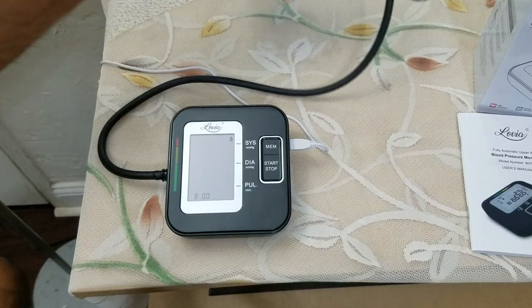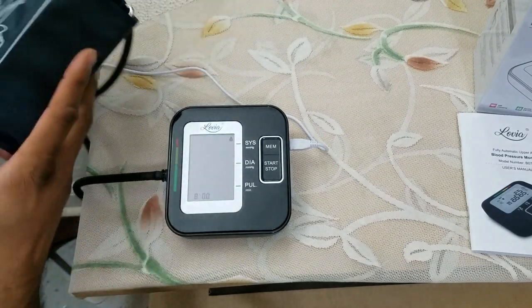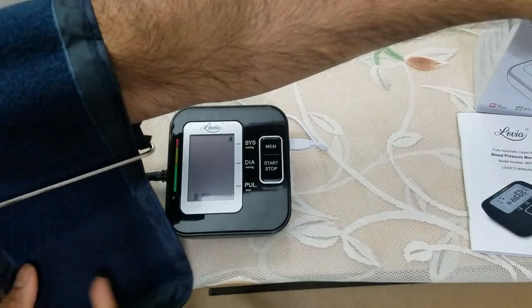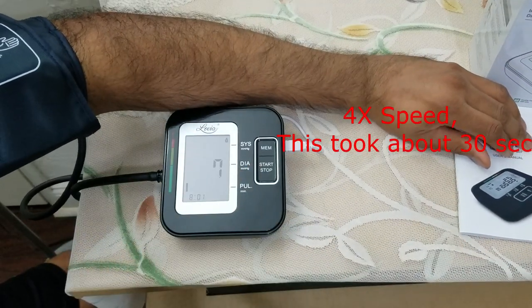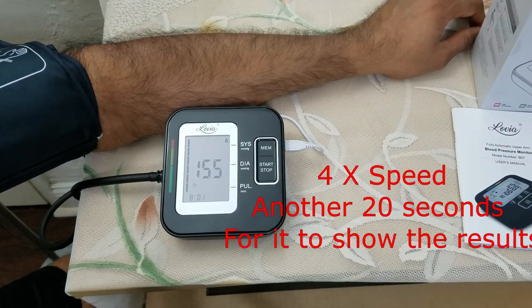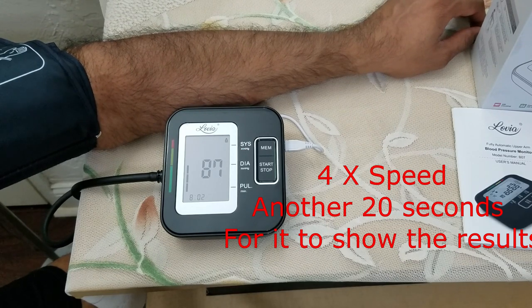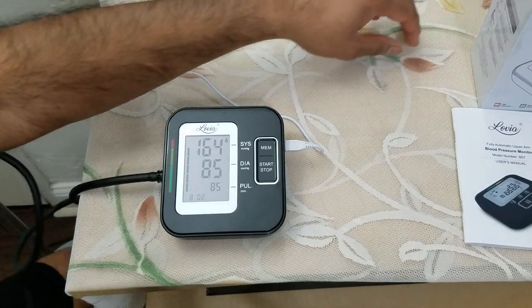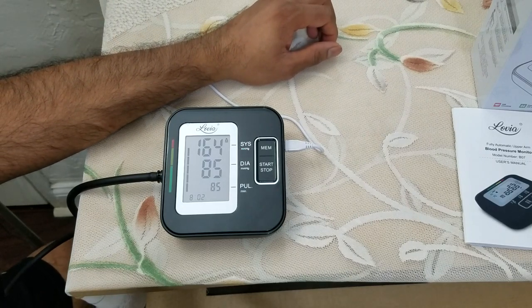Now I'm not a doctor, but I'm going to try this out. The arm goes in like so — very easily. I'm going to start it. And voila, just like that it does everything for you. You don't have to push any buttons to start and stop.